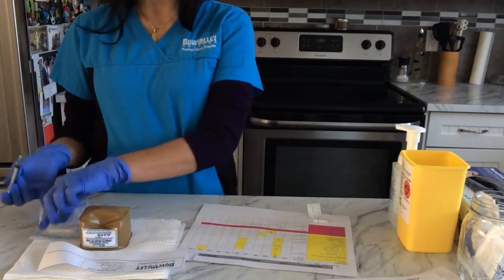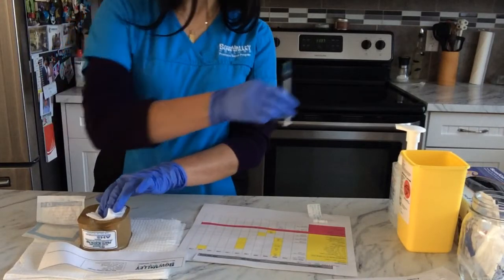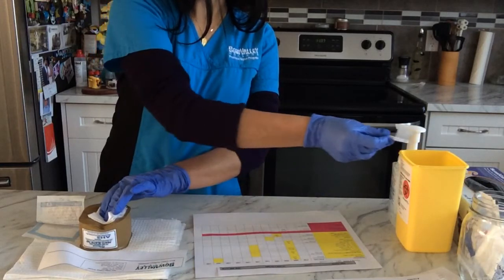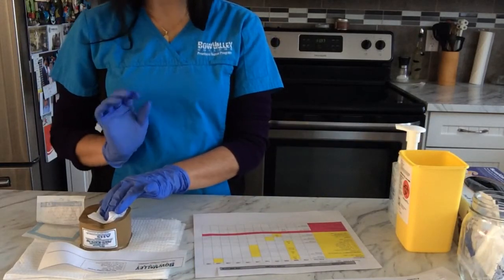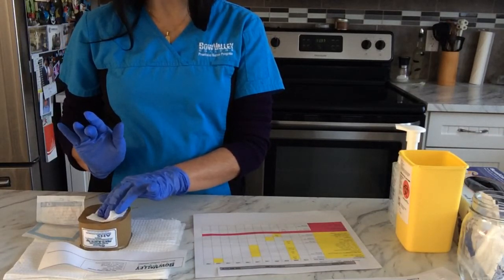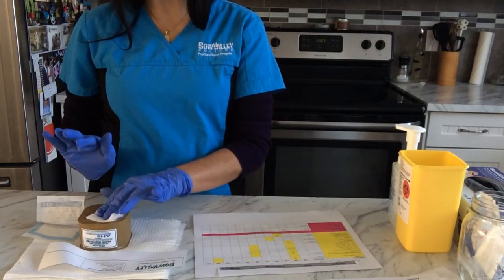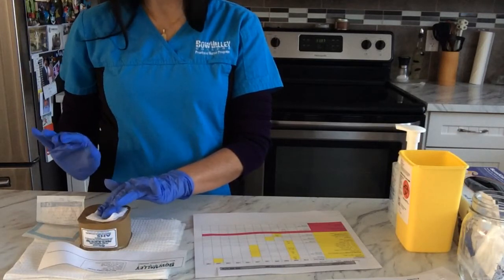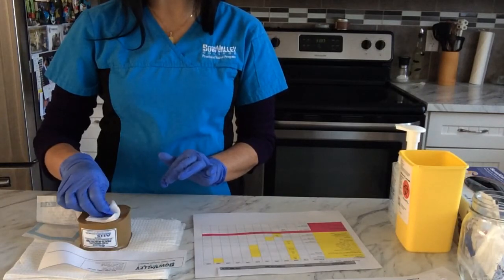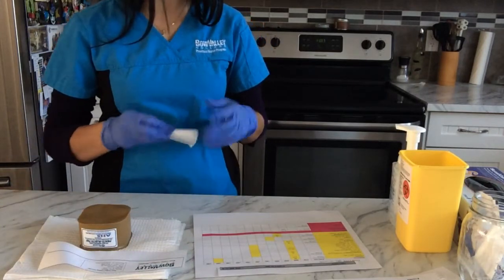Okay, and I have the cap here. I'm not gonna recap, I'm gonna dispose. I'm not gonna massage, I'm just gonna put a little bit of pressure, not too hard. We don't wanna do any harm to your skin. I'm gonna leave it there for a minute. I'm gonna make sure there's no blood coming out, nothing. You're good. I'm gonna put this in the garbage.